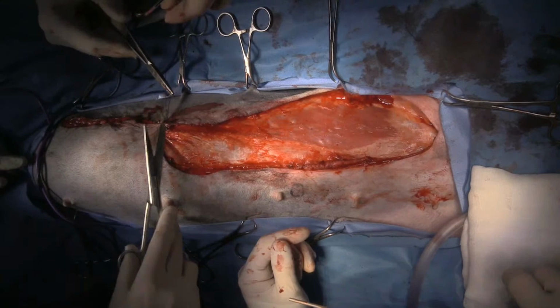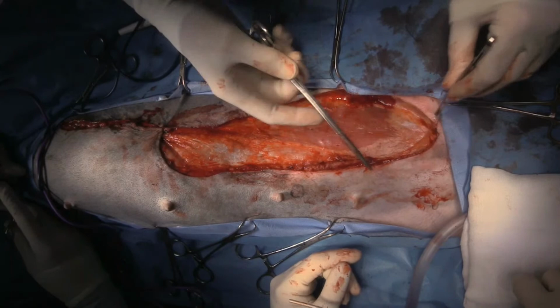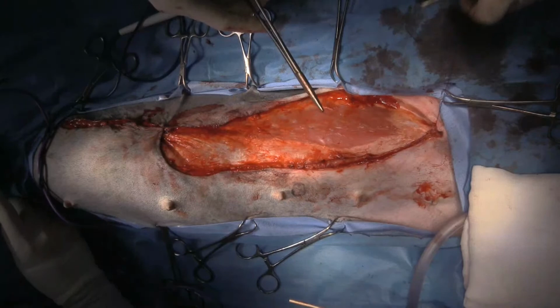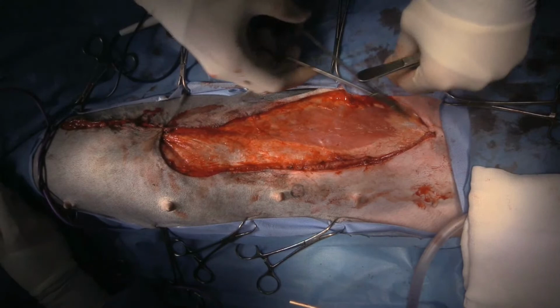Leave that long, yeah. Right? Yeah. Do you want to take that one out with about a centimeter? Tip of the blade is poked through. Pokes through, yeah. Can we get another blade, please? Can you cut that for me, please?